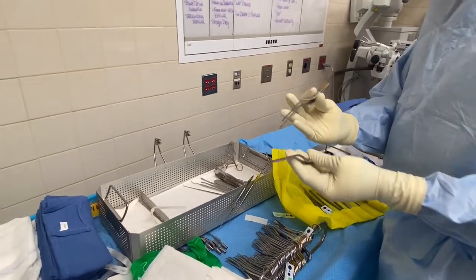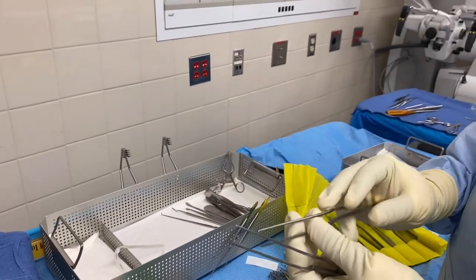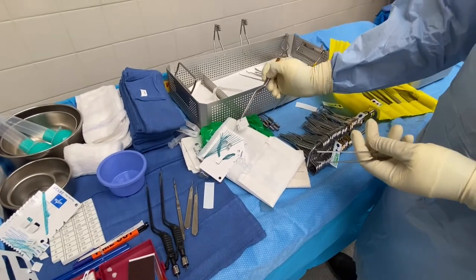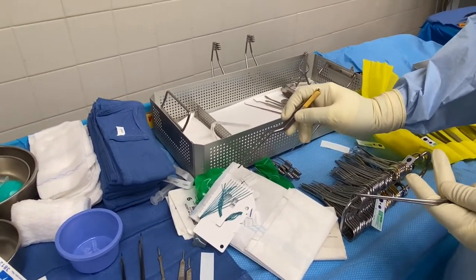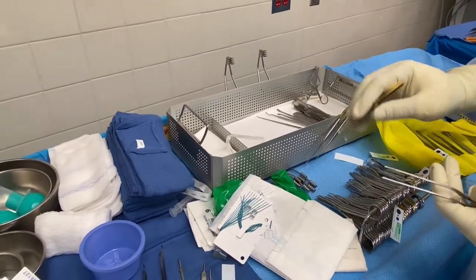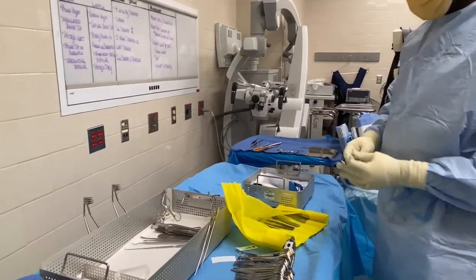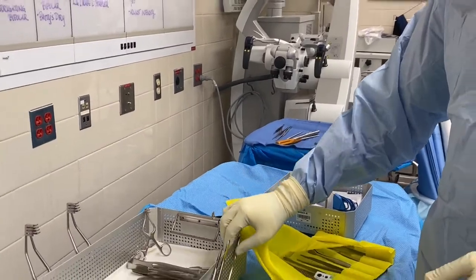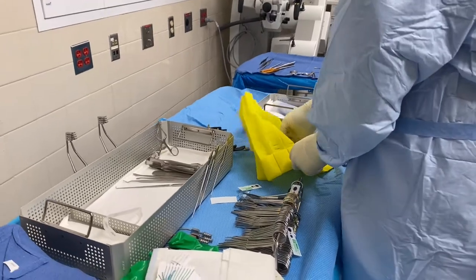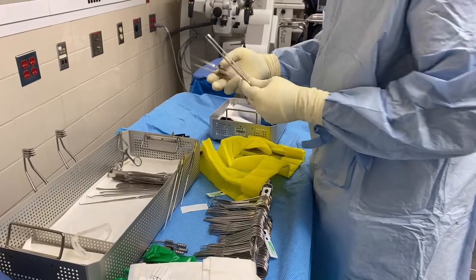This is called bayonet forceps — in any neurosurgery you're going to have these. They're used with the patties; you just grab them and lay it where there's bleeding. Sometimes they also use Surgiflo or FloSeal to stop bleeding while they're working. Have one on the patty tray, one on the mayo stand, and one on standby in case you drop one.